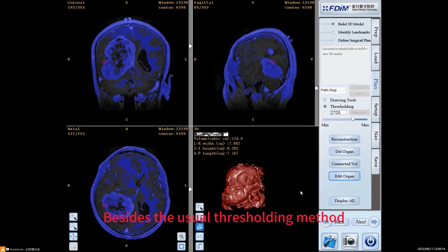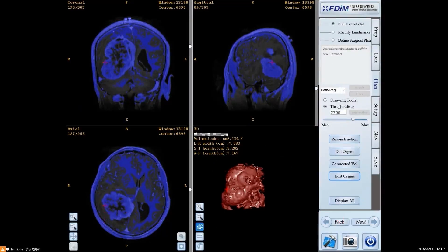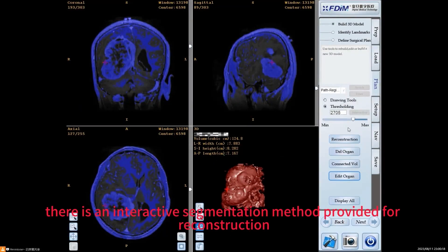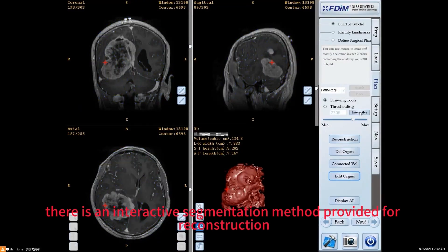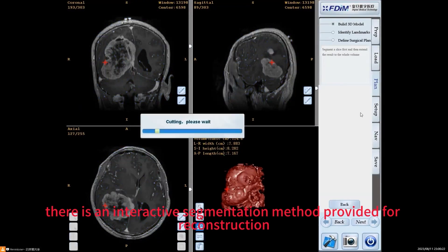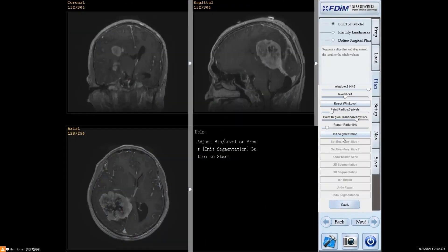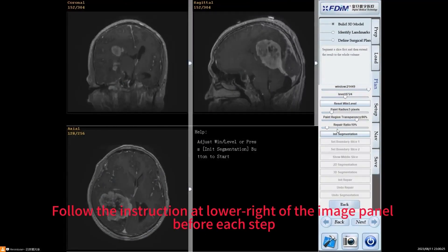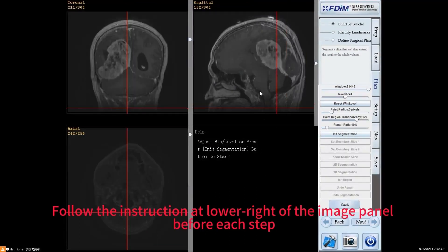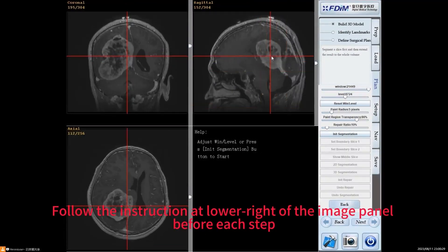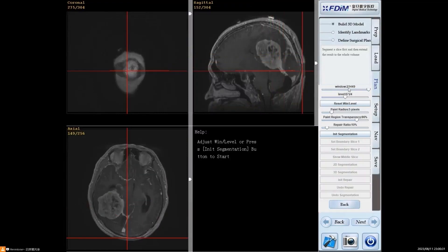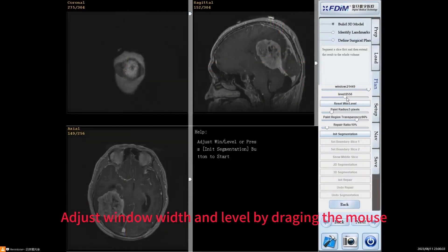Besides the usual thresholding method, there is an interactive segmentation method provided for reconstruction. Follow the instructions at the lower right of the image panel before each step. Adjust window width and level by dragging the mouse.